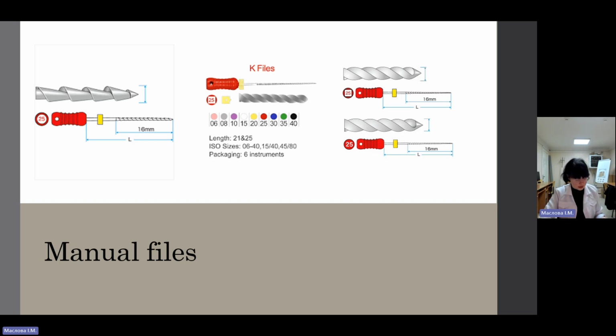These are reamers and files. There are various types of root canal file, and they are mostly made from stainless steel. Files are predominantly used with a filing or rasping action, in which there is little or no rotation of the instrument in the root canal. The properties of different files are related to their design features. The common types of files are K-files, K-flexofiles, and Hedstrom files.